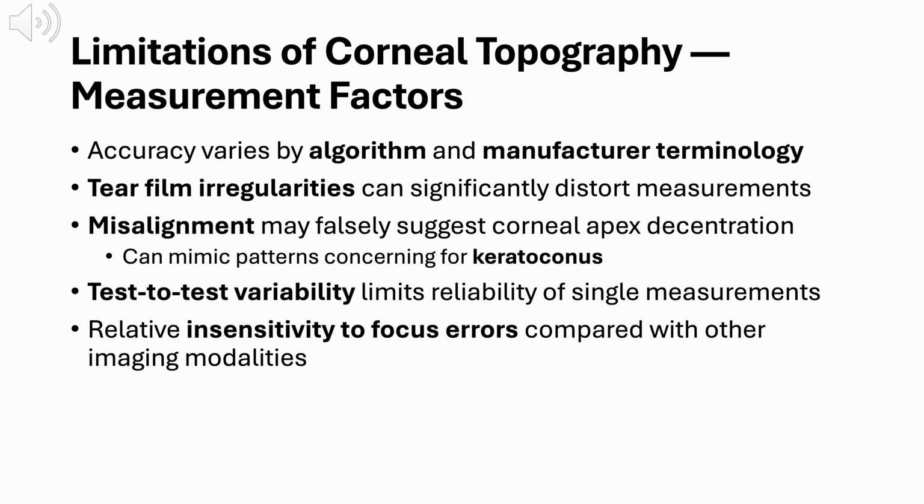There is also inherent test-to-test variability. A single measurement should never be interpreted in isolation, especially if the findings are borderline or unexpected. Trends and repeat scans are far more informative than one data point.